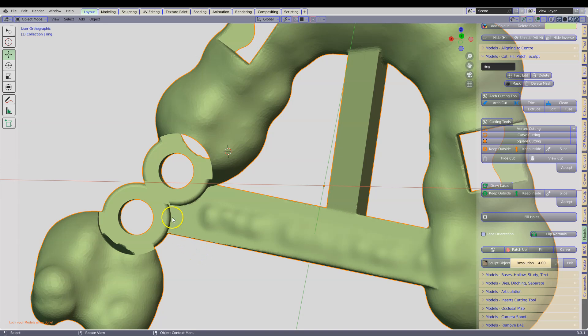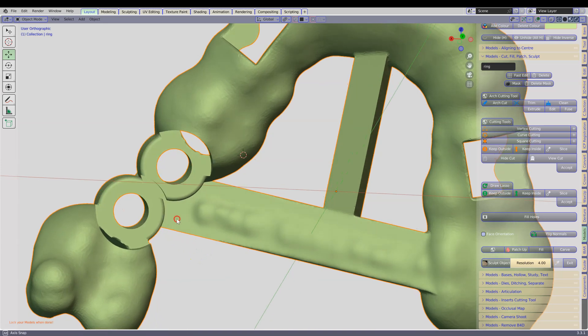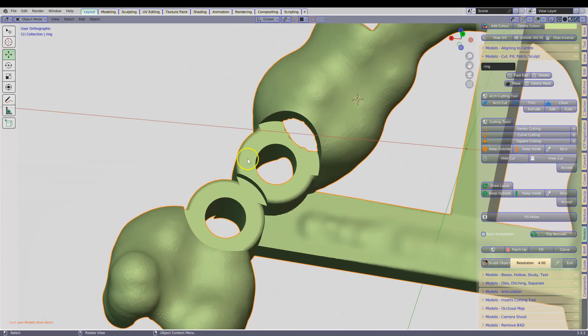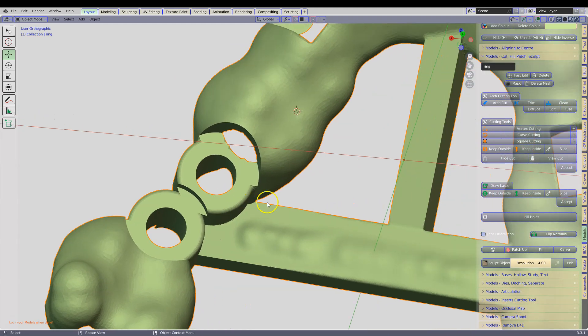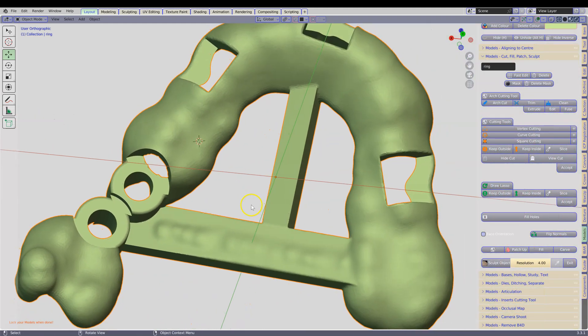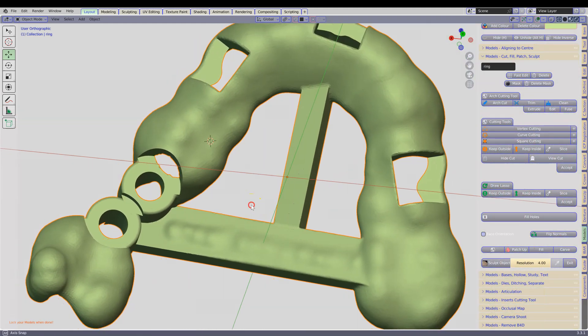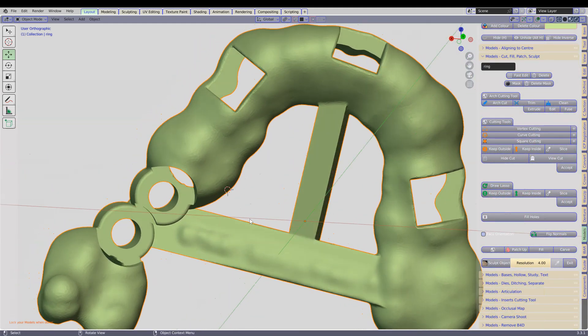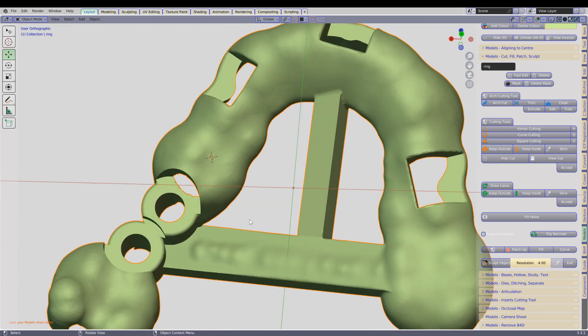We want to add metal inserts into this guide. By the way, this was made in Exoplan and then imported into Blender.